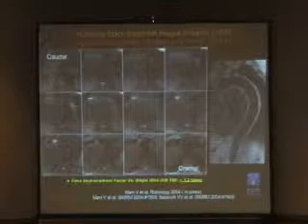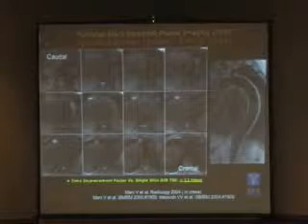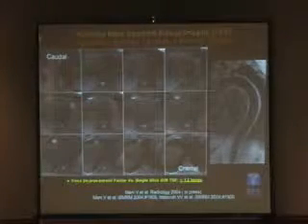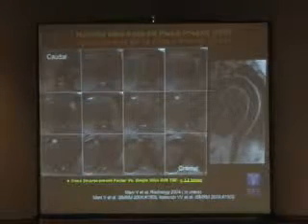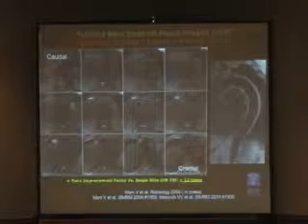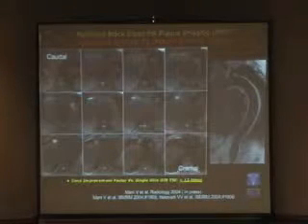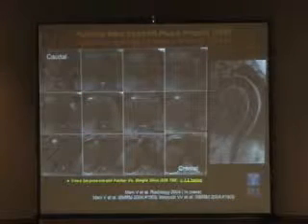I'll just make a little comment here on time, because one of the things that is always mentioned is, oh, MRI takes a lot of time to do, which is actually not true. We're not talking about looking at cardiac function here, where you have to do this over the cardiac cycle and average over multiple cycles, and it takes 20 minutes to an hour to do the exam. I'm showing you here an example of covering from the top of the subclavian all the way down the aorta in a longitudinal axis. This is something that's obtained in less than a minute.